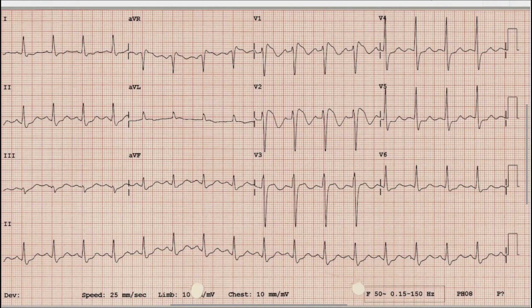The first thing we look at is the presence of upright and prominent P waves before each QRS complex. These upright and prominent P waves before each QRS complex in the rhythm leads indicate that the rhythm is sinus.